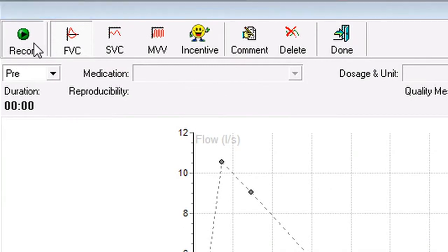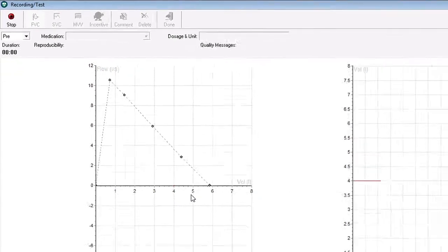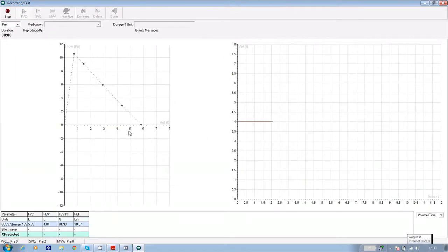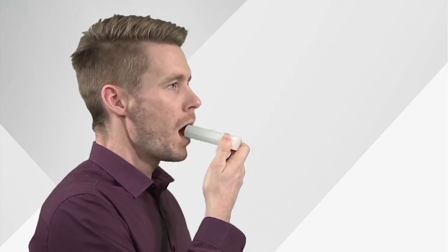Click on record again. Wait for the stabilizing flow sensor message to disappear and then the patient should breathe in as before, place the sensor in their mouth before blowing out as forcefully and for as long as possible before their volume is used up.